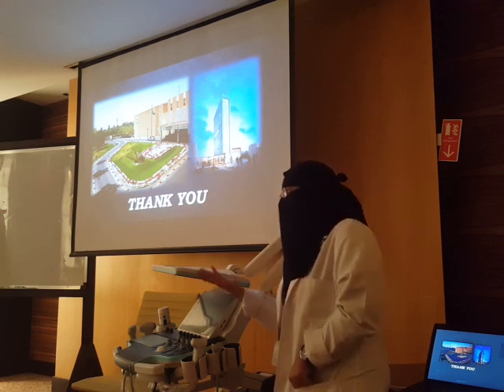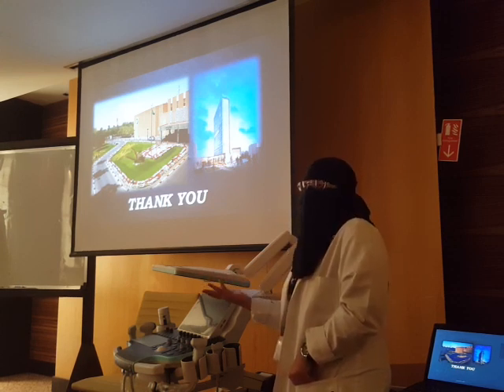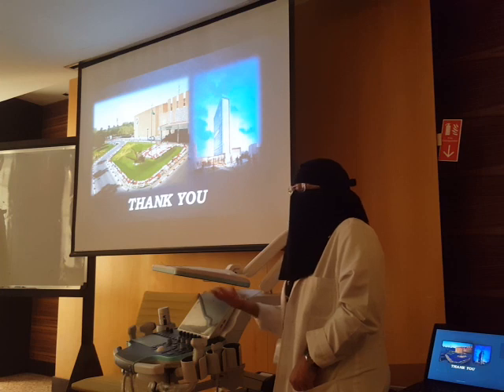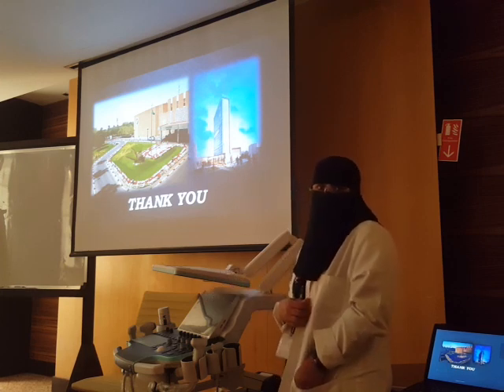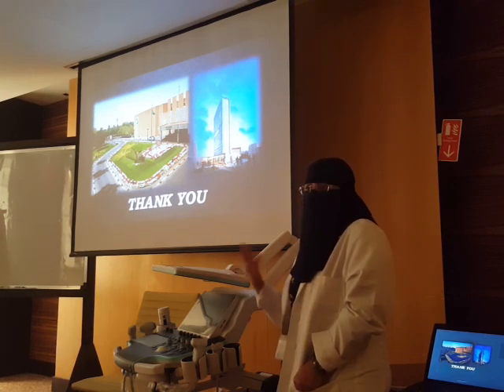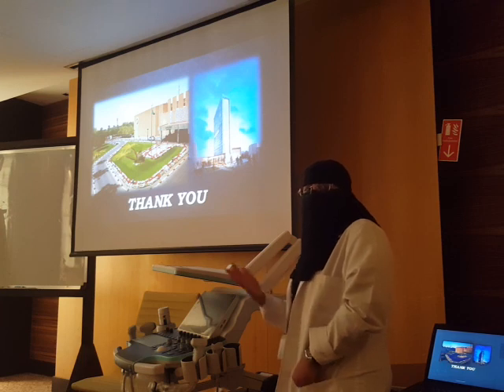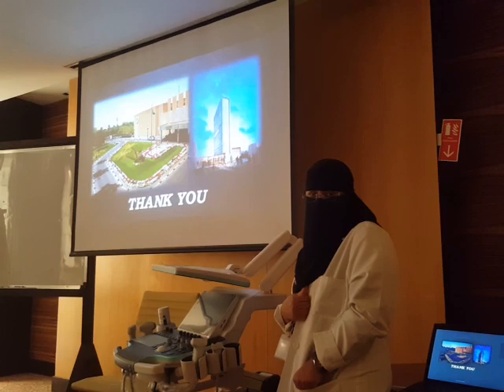Colitis is common when the patients are في chemotherapy, pediatric post bone marrow transplant. Yeah, it's common. We can rule it out easily, even in a general ultrasound abdomen, and we can see it, document it, and see it's typhlitis or colitis. As I said, the pyloric stenosis, it's ICU procedures and not that frequent when outpatients come to us for projectile vomiting. Most of them are inpatients and ICU patients. في محاضرة ثانية.